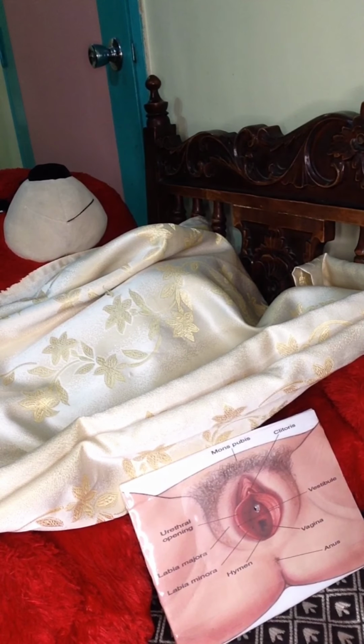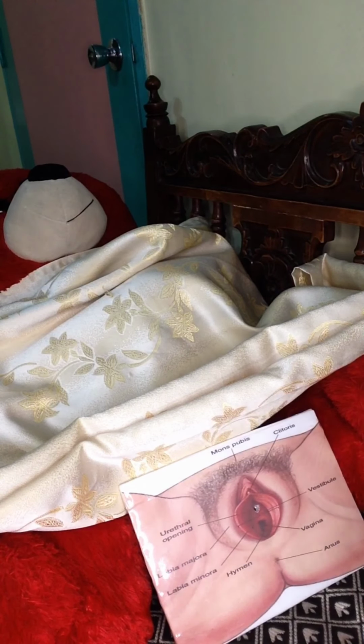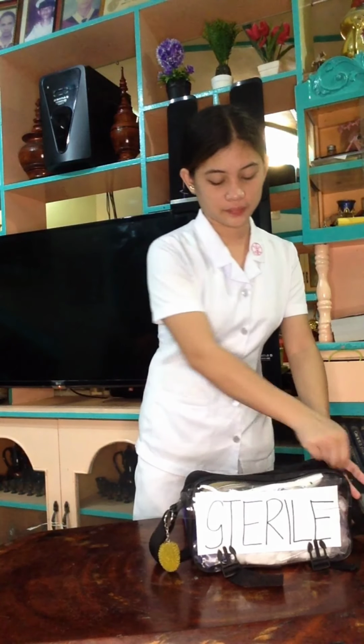So, next is apply direct light for visualization of the genital area. This is to have proper lighting. So, this is my flashlight. So, next is open the tray and arrange the equipment accordingly. This is to avoid contamination of sterile items. So, these are our sterile items.